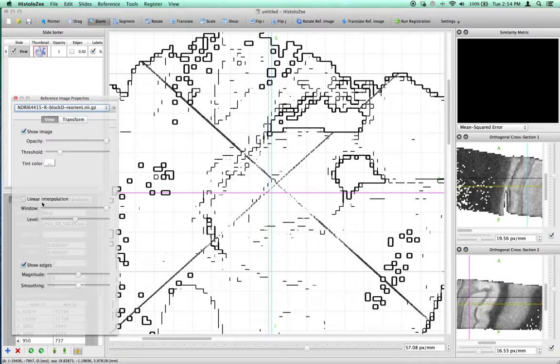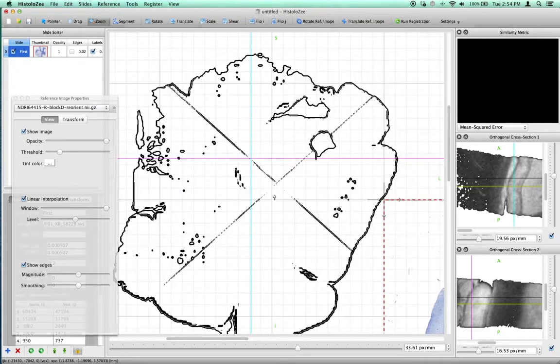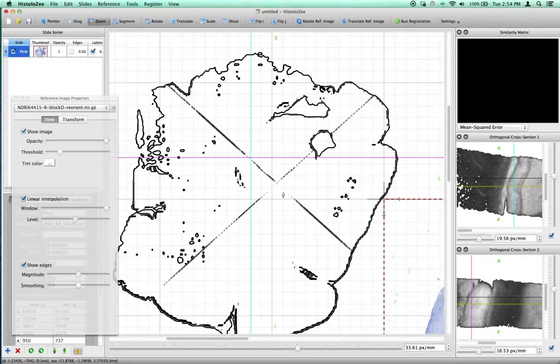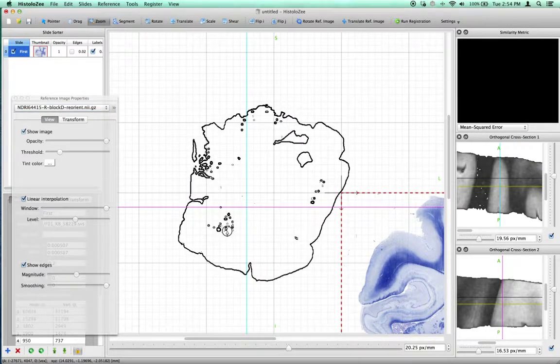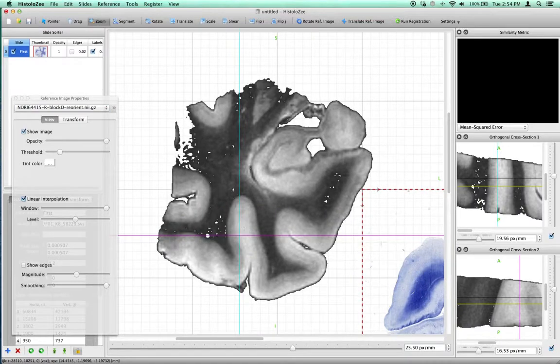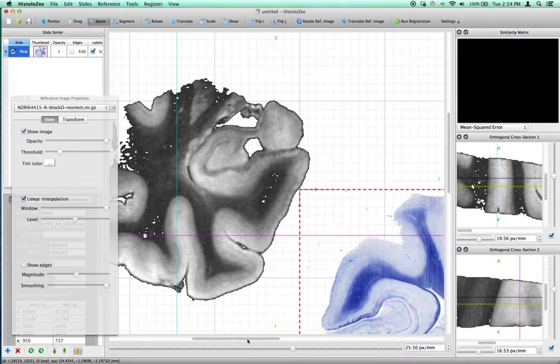And we can also put edges on. Again, my particular graphics card has a bug which shows these X's, but most desktop GPUs, graphics cards, don't have this bug. So we can view our MRI using just the edges or in the original format.